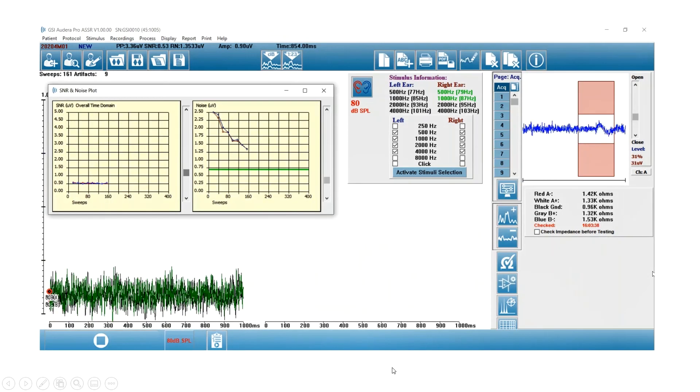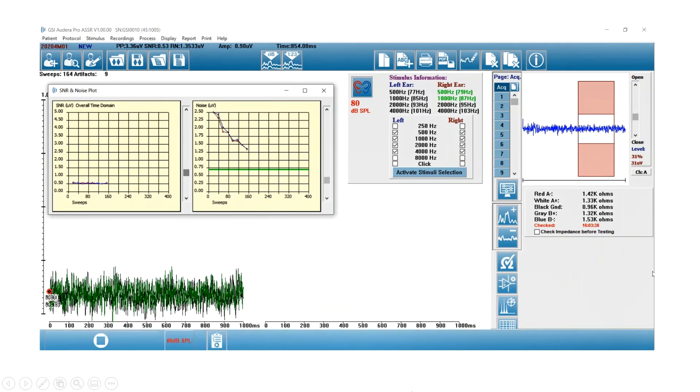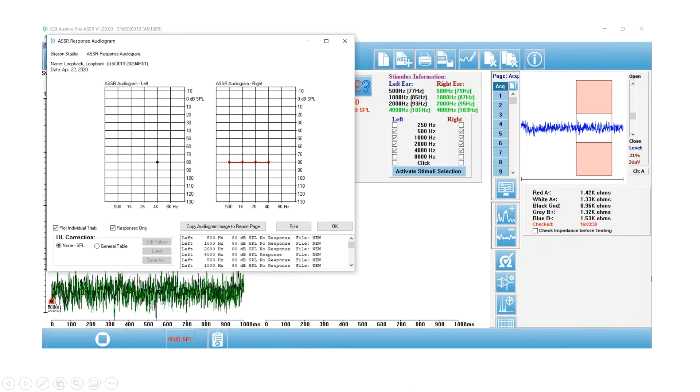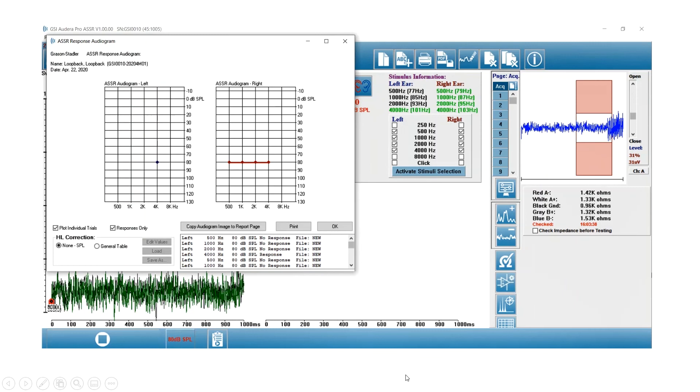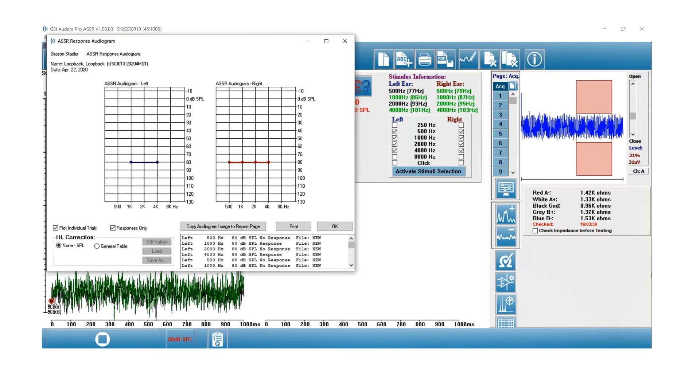And then moving on to the last graph. This is further along in the testing, and now instead of the polar plot, I've launched the audiogram.